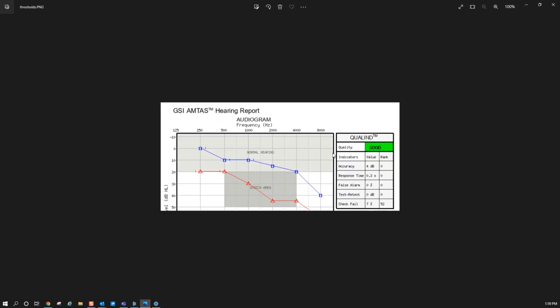In addition to the noise report itself, you will see on the audiogram at any frequency where noise may have been an influencing factor during testing, you will see these exclamation points by the thresholds saying that the maximums were exceeded for those octave bands based on your criteria.